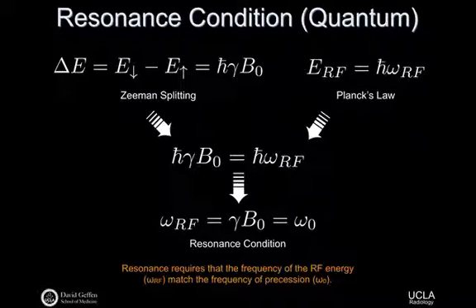That's the difference in energy between those two states. On the right-hand side, governed from Planck's law, we know that the energy for a radio frequency electromagnetic wave is governed by Planck's constant and the frequency of that wave itself. So now we can set up an equivalence here and just define for ourselves what we call the resonance condition.